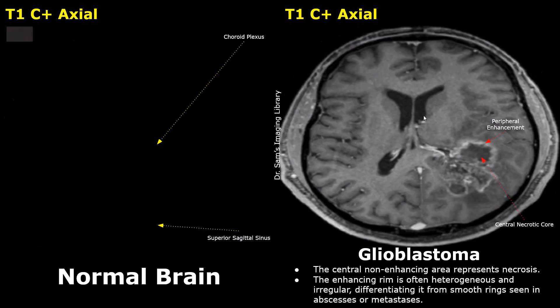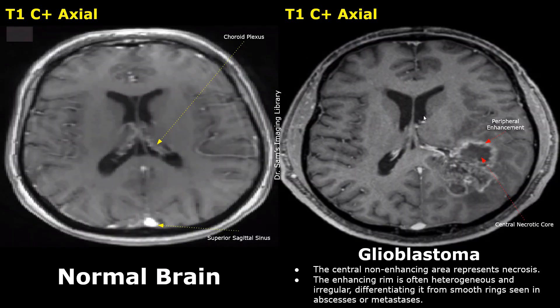Diagnosis on MRI is not made by studying one sequence alone because many lesions appear similar in one sequence. So the imaging findings are always studied in multiple sequences. We are taking this step by step. Now we will look at T1 contrast images, which are very helpful in the diagnosis of glioblastoma and have very specific findings. We will study T2 and other sequences later on.